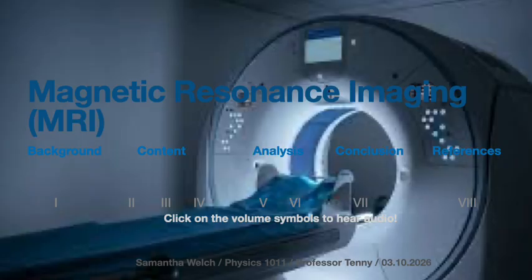Sensors inside the MRI scanner detect the signals released by the hydrogen nuclei. A computer analyzes those signals and determines where they originated from inside the body. Because different tissues release different signals at different rates, the computer is able to reconstruct a cross-sectional image of internal structures with great detail.